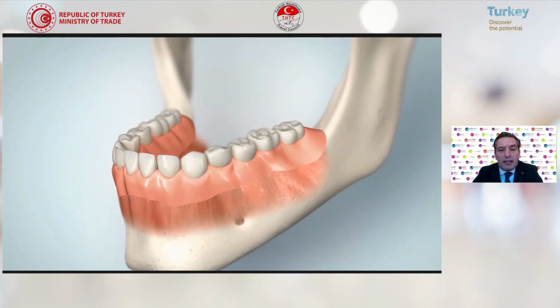The patient can remove the prosthesis from the mouth and then place it in the mouth again. But in All-on-4, the previous one, the patient should go to the dentist for checks and to take the prosthesis out, because it's screw retained, and only a dentist can take the prosthesis out.